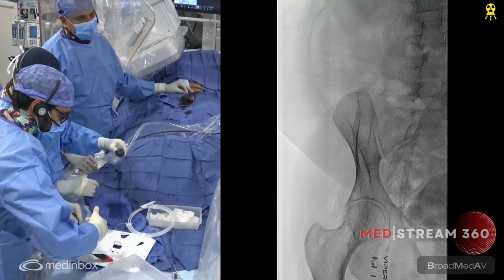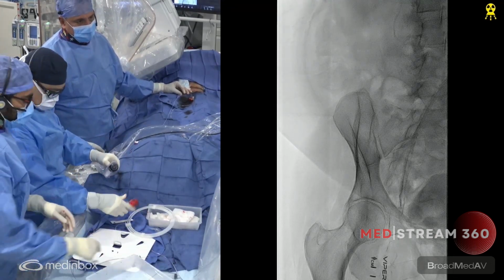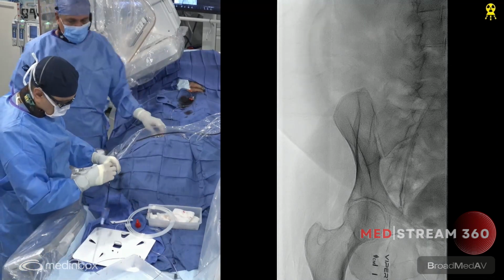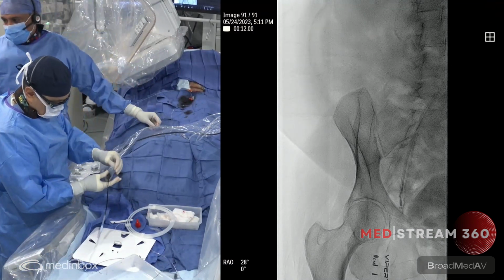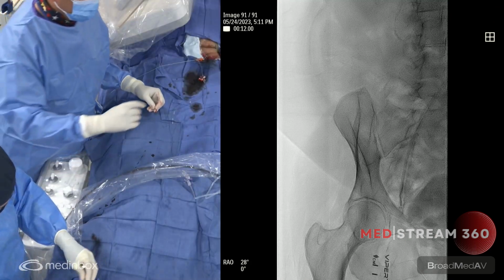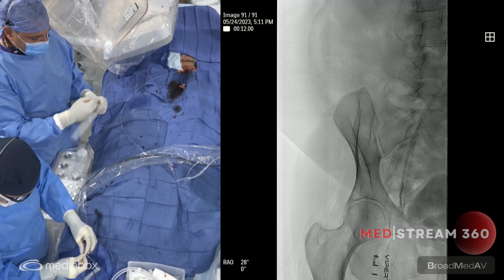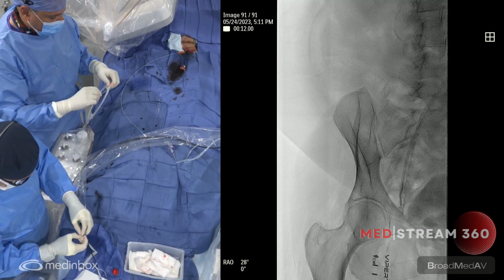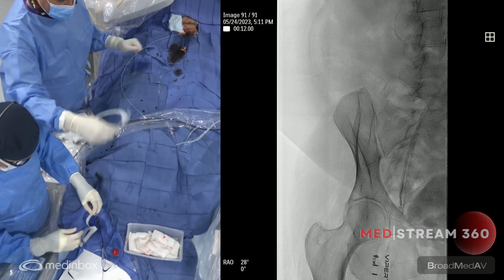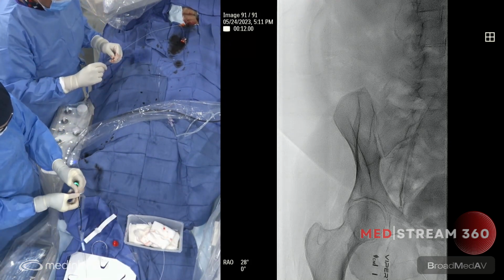I'm just taking a steerable catheter, and I'm just going to ask Ibrahim or Ray to give me a woolly wire to put inside this to steer the steerable catheter into the superficial femoral artery. Can I get a woolly wire, guys? For everybody, I think knows what a woolly wire is. It's obviously a floppy tip wire with a reasonable amount of body here. So as Ibrahim and I will just steer this in as Ray gets everything ready.